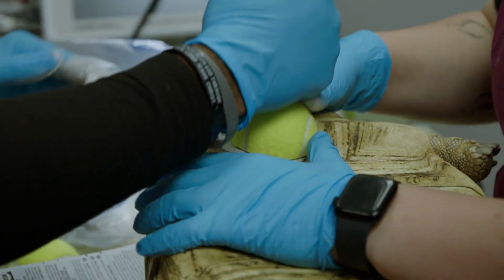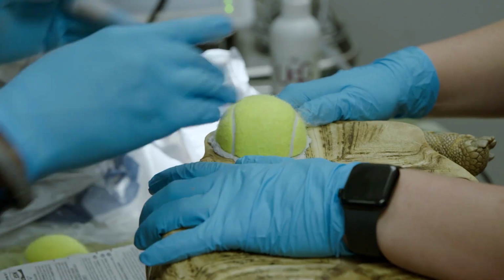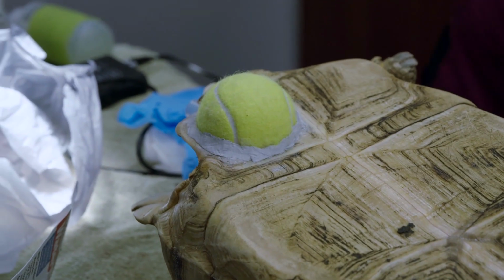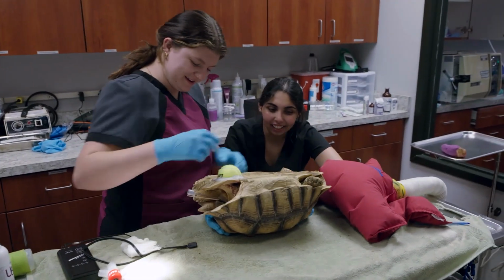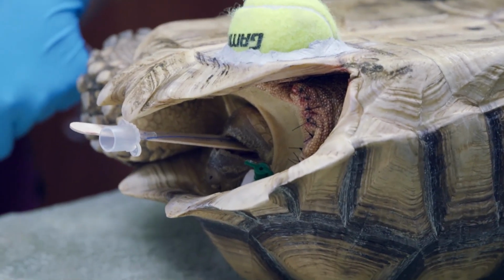Set time of 15 to 25 minutes. So I'll put a prosthesis on her, something that I made up with like a tennis ball. So I just hope she's able to keep it on for a good amount of time. Oh, good morning. Good morning, sunshine. So she's starting to recoil her head now.